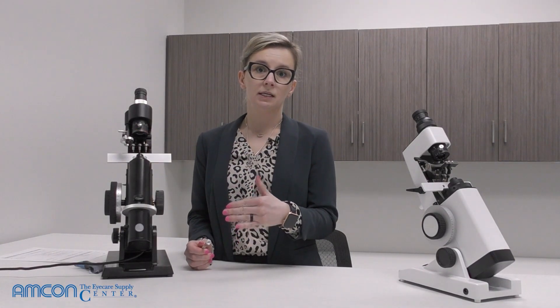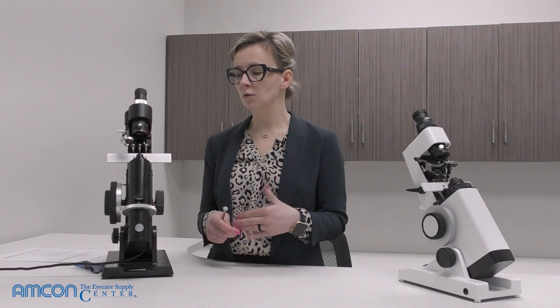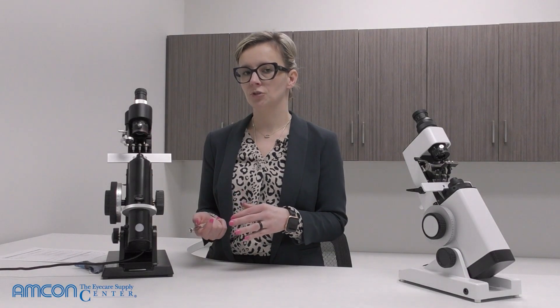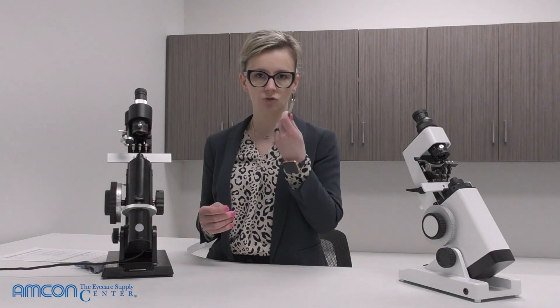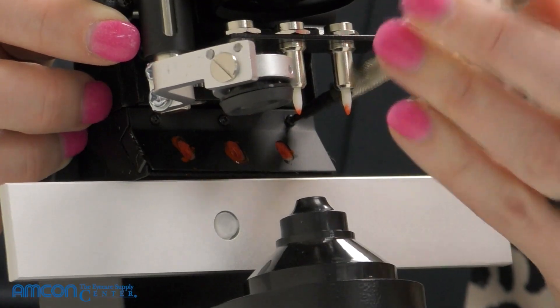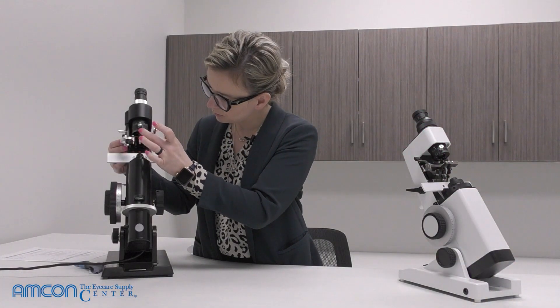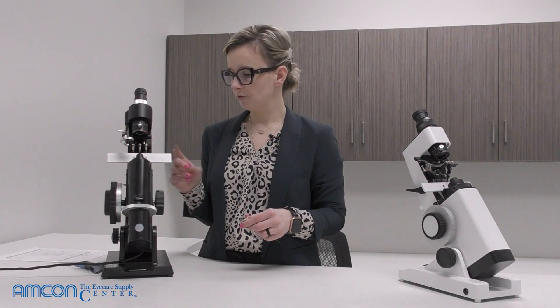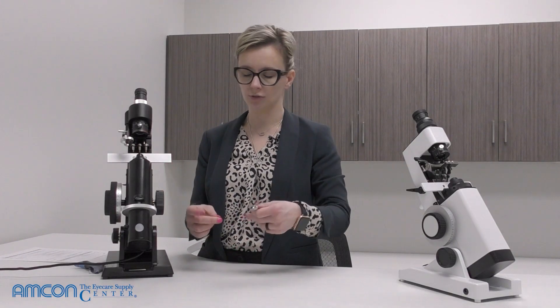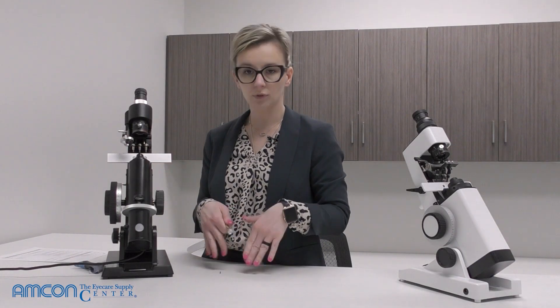If you've added ink multiple times and it's no longer absorbing well, or the ink pad is very pressed down and almost matted, it may be time to change the actual ink pad. To do that, grab a Phillips head screwdriver and lift your pins up. There are three Phillips head screws on this lensometer — unscrew them. Having a magnetic pad is helpful because if a screw falls out, it won't roll off the desk.